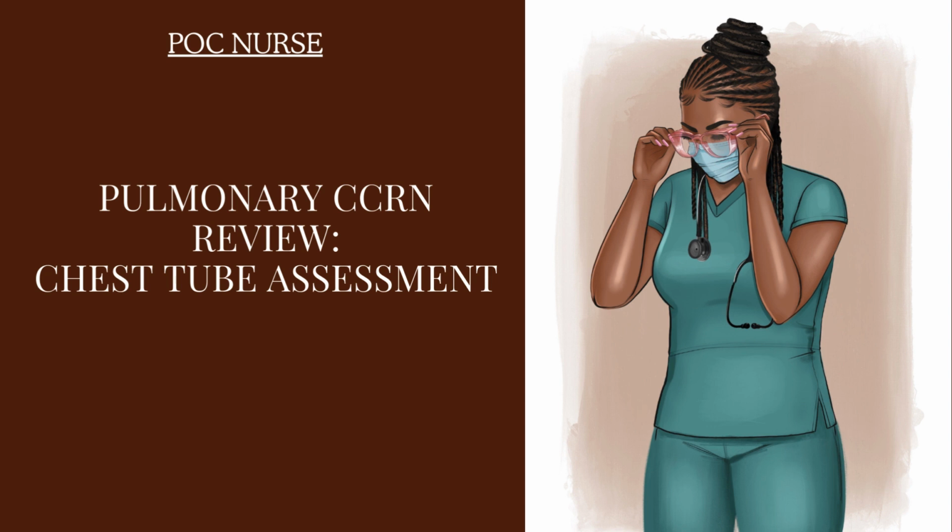When you don't see tidaling, there could be a kink, a clot, or some kind of occlusion in the tubing system, or the patient's pneumothorax or hemothorax or whatever it is that we're draining out of the patient's chest is completely drained out. The lung is completely re-expanded and the patient is healed.